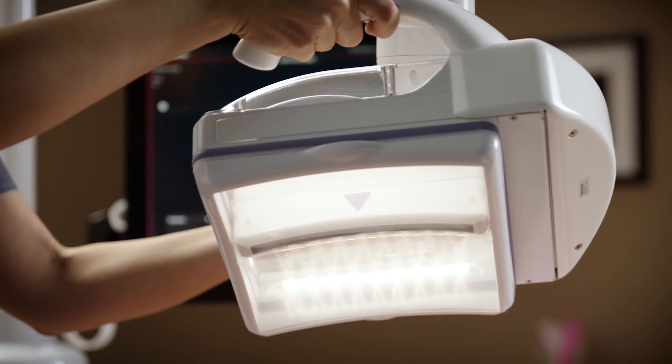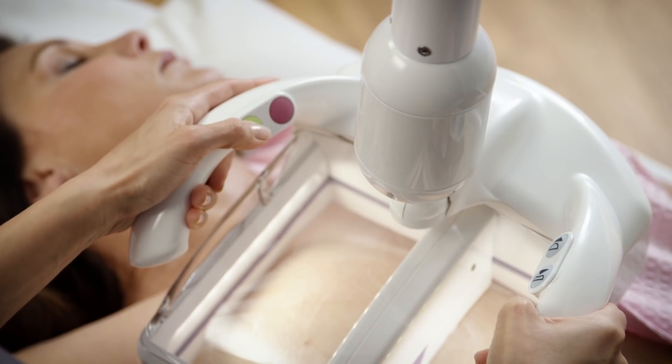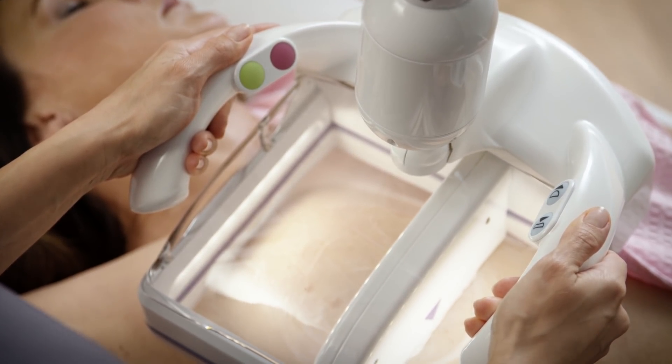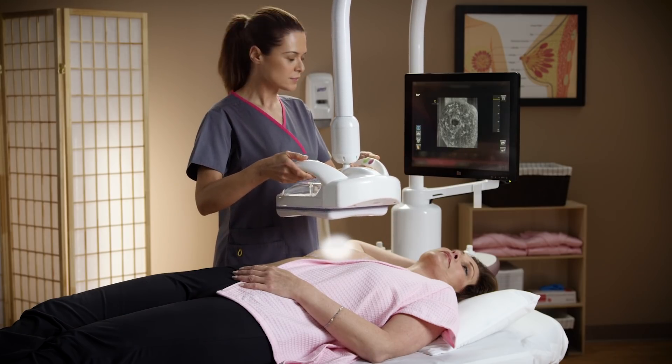The scan head assembly houses the exclusive 15 centimeter reverse curve transducer, which conforms to the female anatomy. With the touch of a button, the operator begins the acquisition. The transducer moves from the inferior to superior edge, and each acquisition takes under one minute.